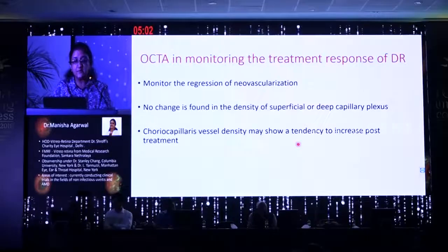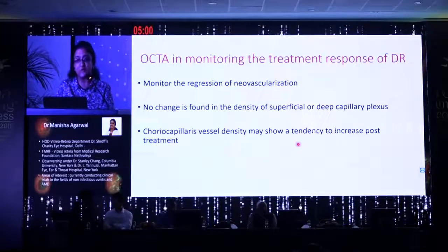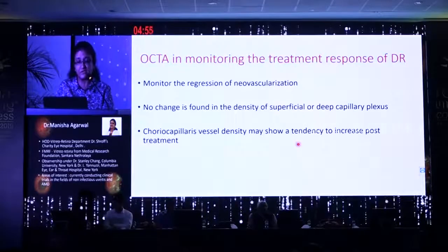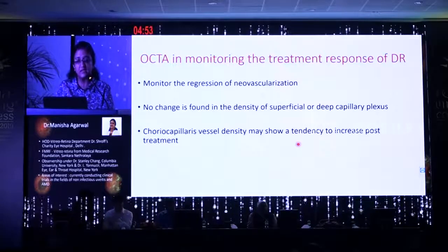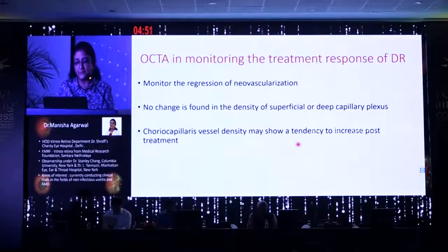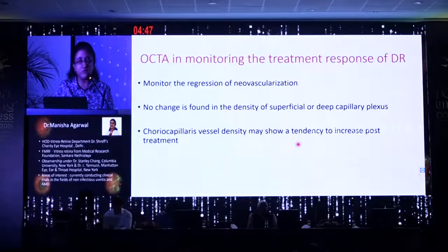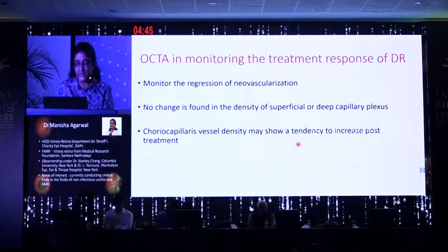So OCTA helps in also monitoring the treatment response of diabetic retinopathy. You can actually see the regression of the neovascularization, though there may not be much change in the density of the superficial or the deep capillary plexus. The choriocapillaris I won't touch upon because Dr. Munna explained it beautifully yesterday.